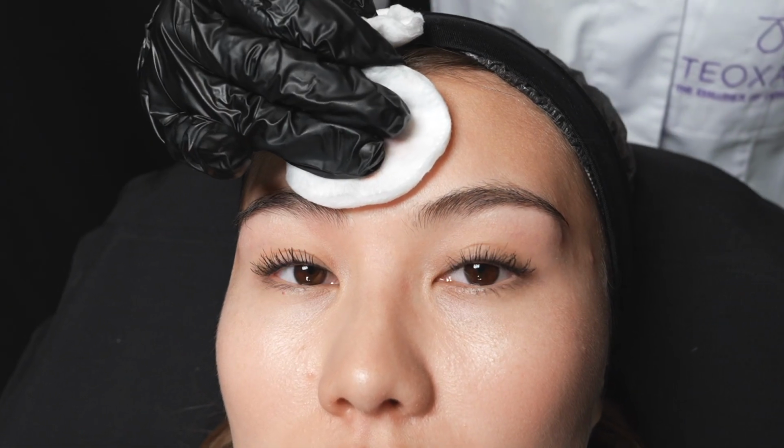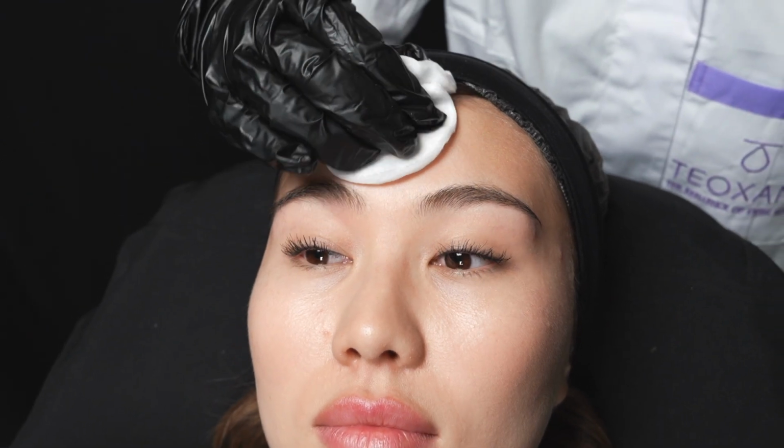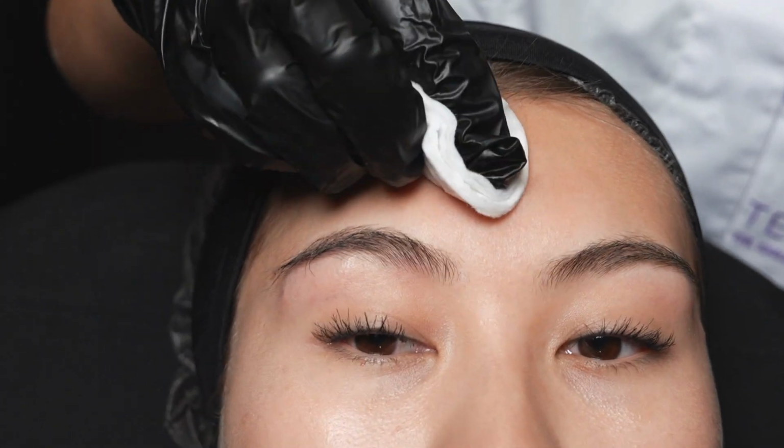Итак, я сделал инъекцию височной зоны с обеих сторон, потом инъекцию в брови и инъекцию в лоб. То есть RHA 4 приблизительно по 0,5 с одной стороны и с другой. Далее лоб RHA 3, 1 миллилитр, небольшие корректировки объемом 0,2, и брови RHA 2 с использованием канюли. Что касается височной зоны, то там револьверная техника, лоб, инъекция под фронталис, под гале, инъекции в область виска.